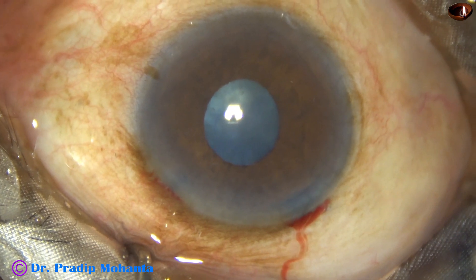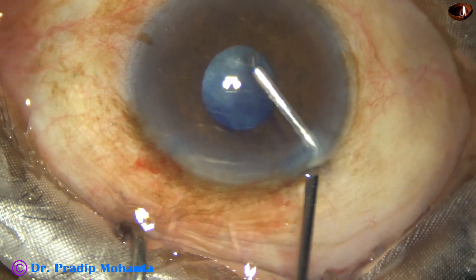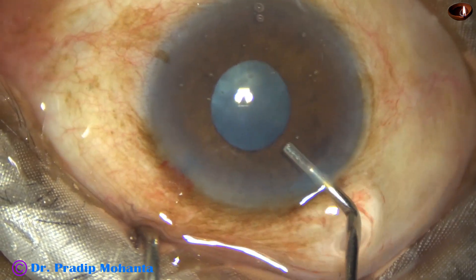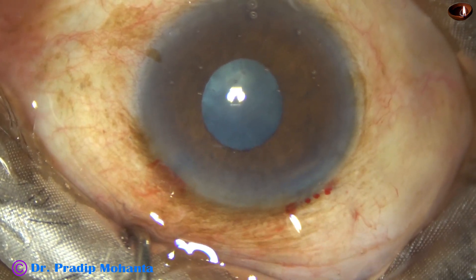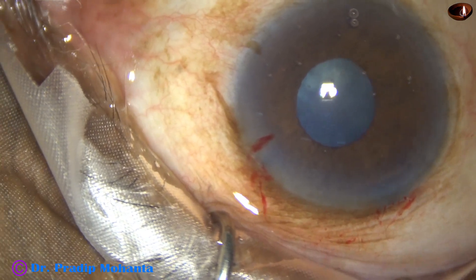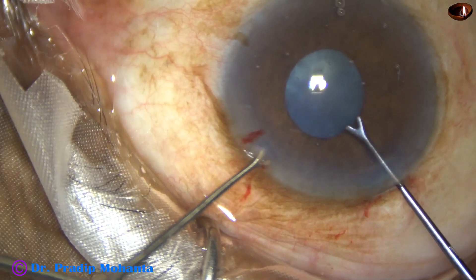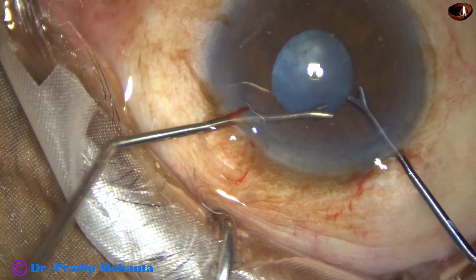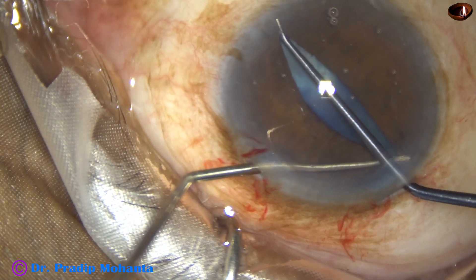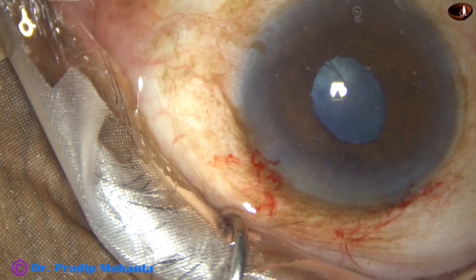To do this case, I have already decided to use a pupil expansion device. The device I have with me is B-hex. And before applying the device, I am going to stretch the pupil with Y retractors. The shape of this instrument is like the letter Y, so we can call it Y retractors.